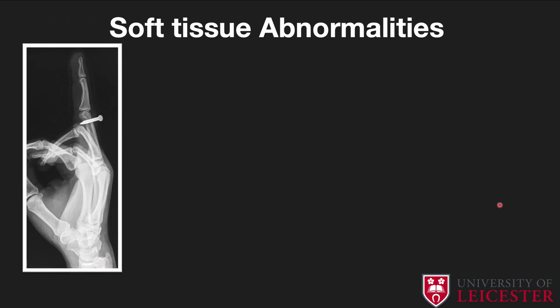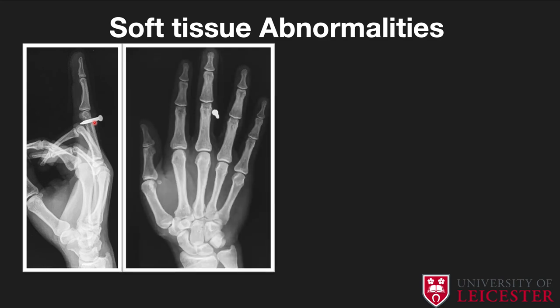Finally, regarding soft tissue abnormalities: always remember the importance of two views and of assessing tissue densities. Look for foreign bodies — here a nail through the third proximal phalanx near its neck. Metallic foreign bodies are very radio-dense and straightforward to identify. Also assess for hematoma or soft tissue swelling. After assessing the bones, always look at the soft tissues.